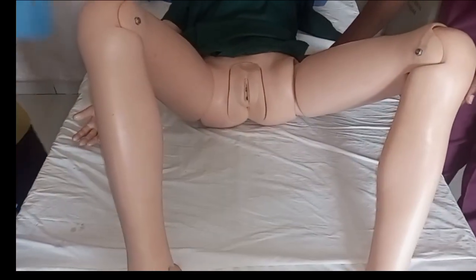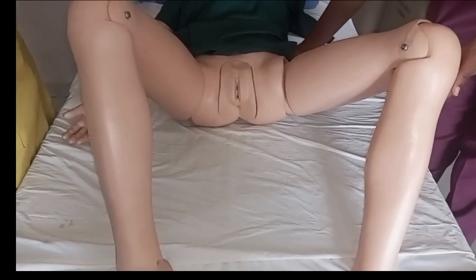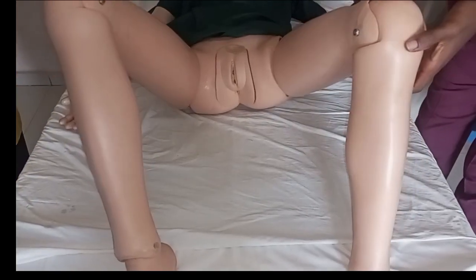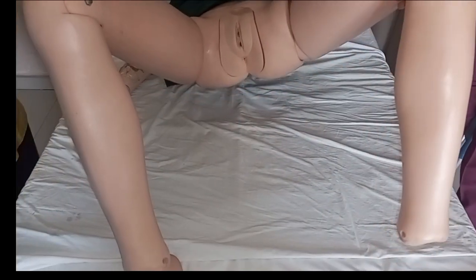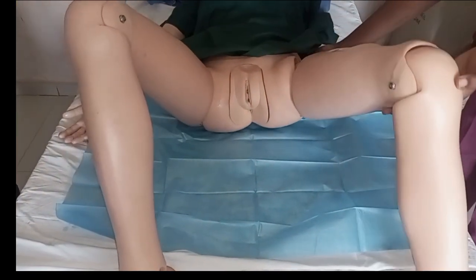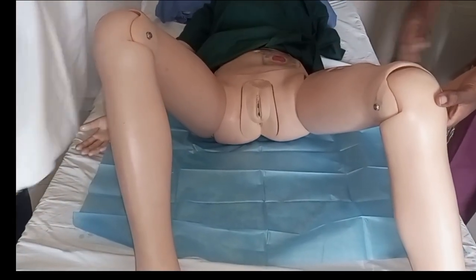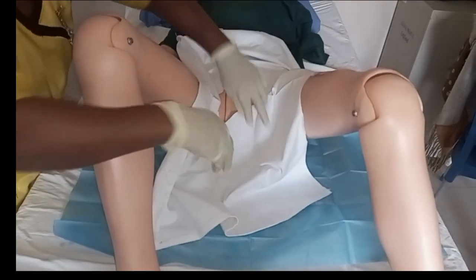Of course, it may be a two-person procedure. Ask your assistant to help you lift the patient's buttocks. Remember, in this procedure you have to allow your patient to lie down dorsally with knees flexed. Have your assistant lift the patient's buttocks and place the sterile drape under the patient. This is a sterile procedure. Also place the fenestrated drape over the patient's vaginal area.